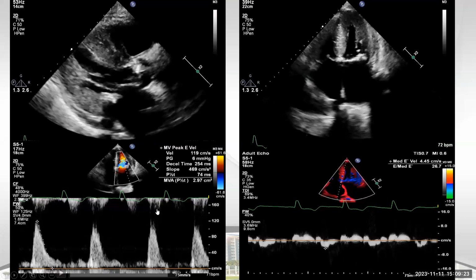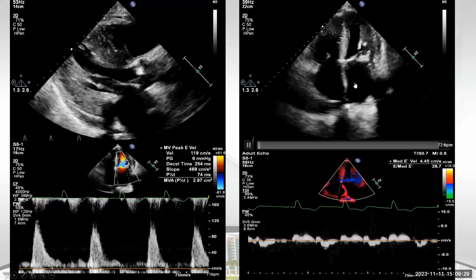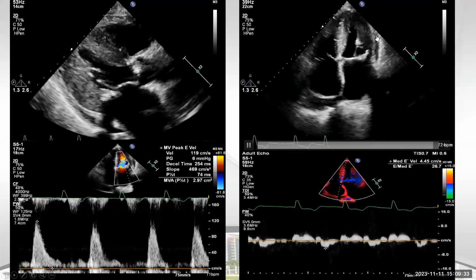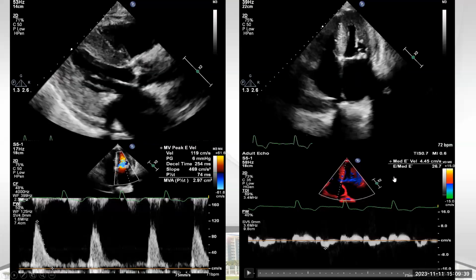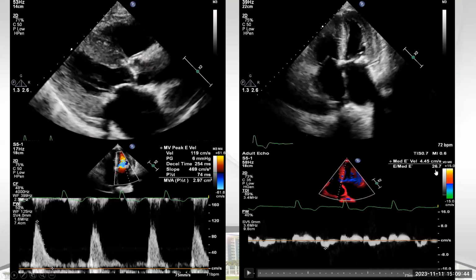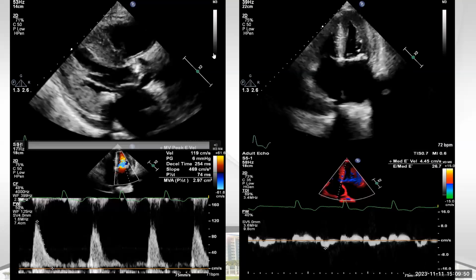And you can see that we have atrial fibrillation here, irregular pulse, and we don't have P wave. You have dilated atria, dilated RV, severe LVH, small pericardial effusion, and the E velocity is high, 120. The E prime is very low, so we have very high LVEDP, or E over E prime ratio, 26. So all of this is suggestive, as you said, of amyloid heart disease.